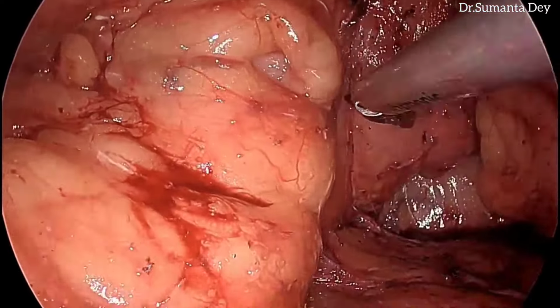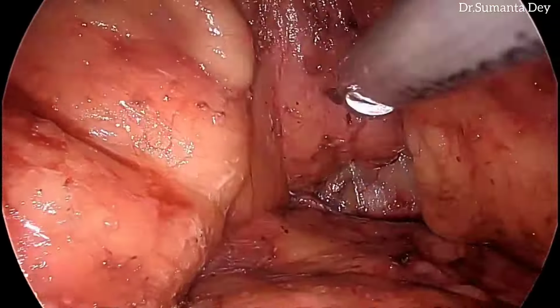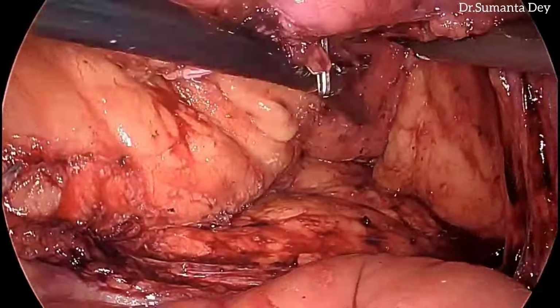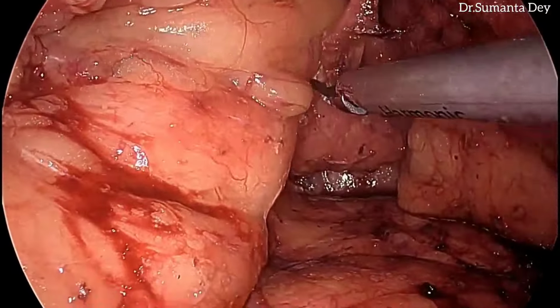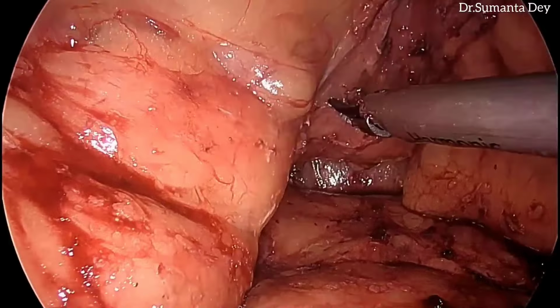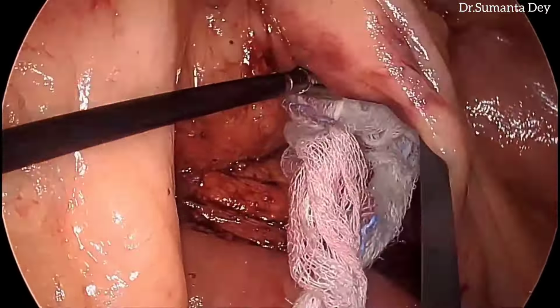There is a bulky mesocolon, a bulky left mesocolon that you can see, which is being gradually lifted off very gently with a good amount of traction and counter traction. Good camera assistance is required to visualize this area, because sometimes you may tend to lose the plane.